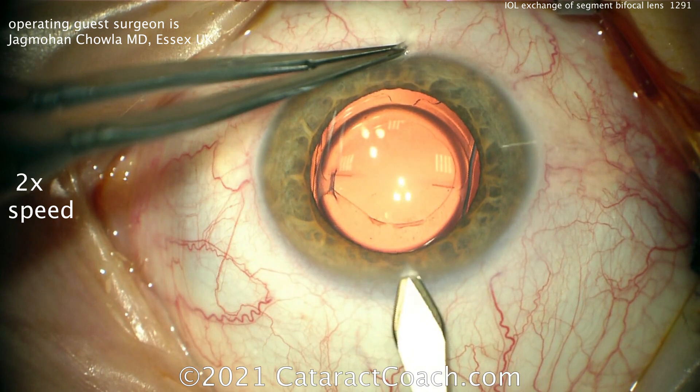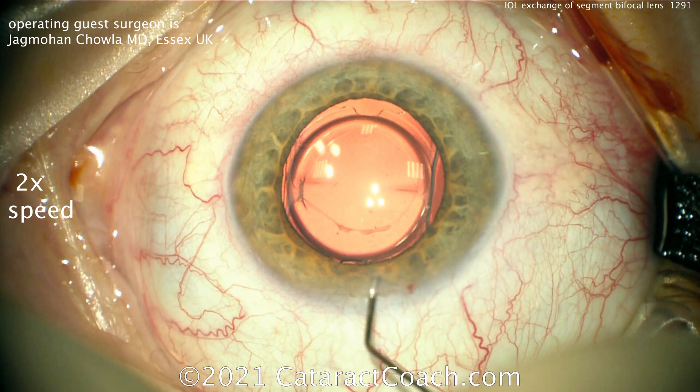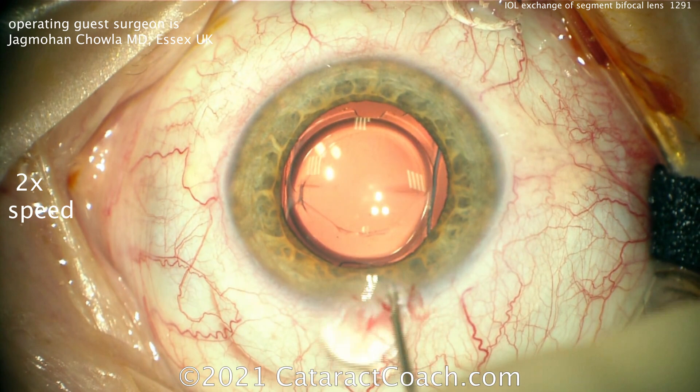This patient had a single-piece acrylic lens with a segment bifocal. The bottom half of the lens is aimed toward near vision, the top half toward distance vision. This segment bifocal lens has been popular in other countries — not available in the USA — for many years with reasonable performance, but you still can't cheat physics. This patient was not happy with the lens, especially for night driving.